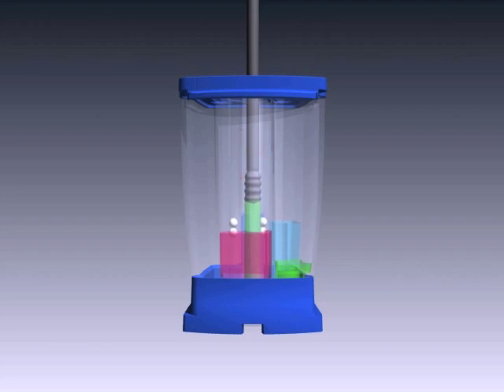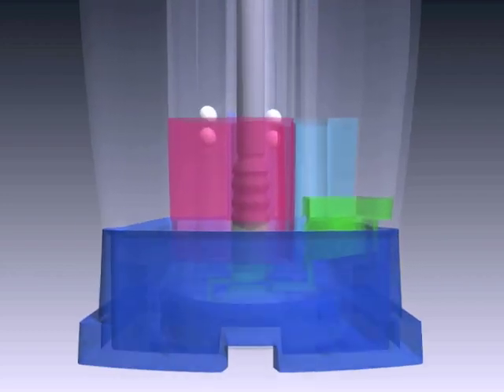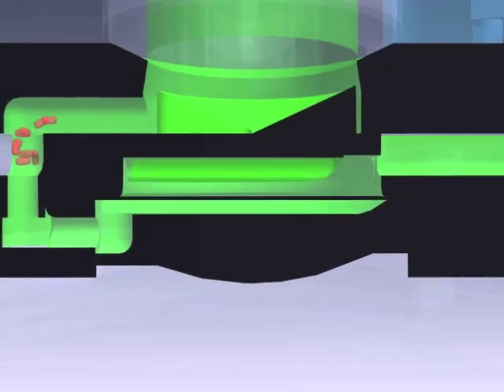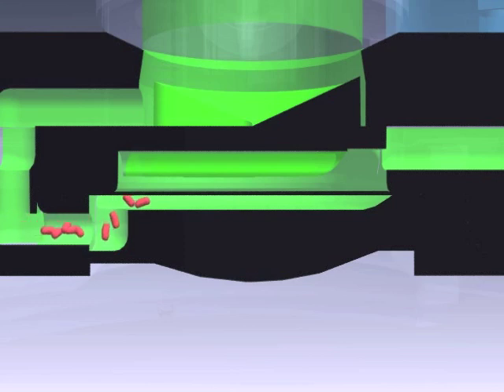The valve body rotates to position two and dispenses the sample through the active area. Here we see the organisms being trapped on the filter while the remaining fluid is dispensed into a waste chamber.